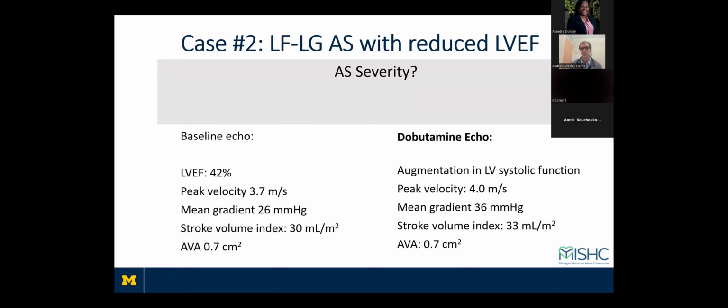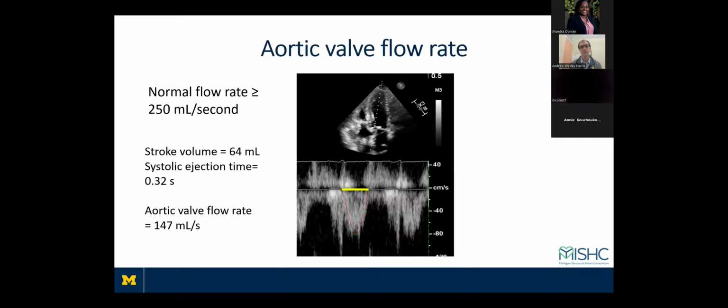That'd be truly severe. Yeah, exactly. So this is true severe aortic stenosis. Good. So this patient was treated with a TAVR and is feeling a lot better. His LV function has improved and he's able to return back to his previous activities.